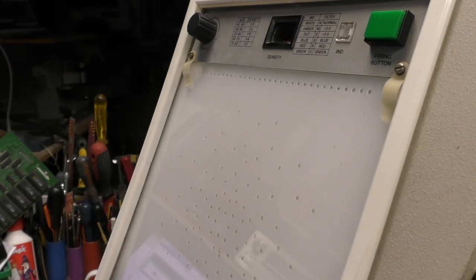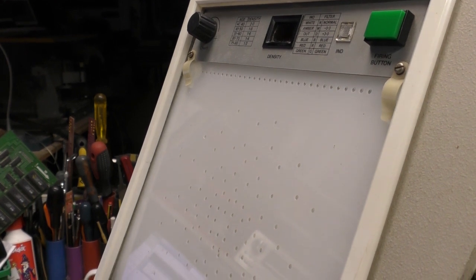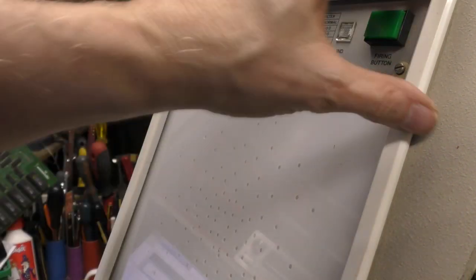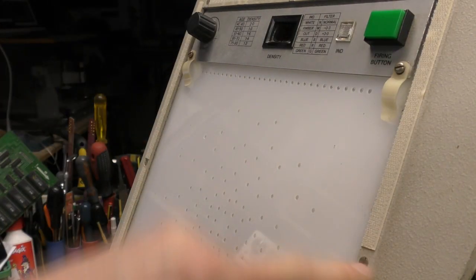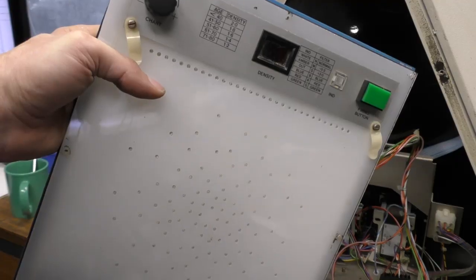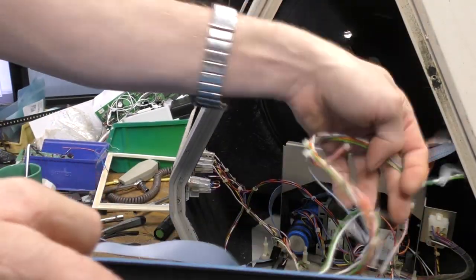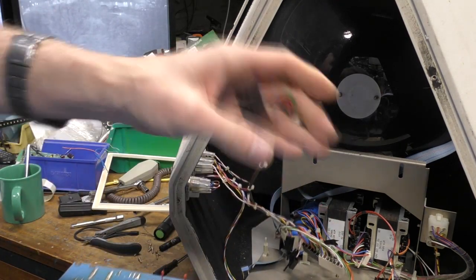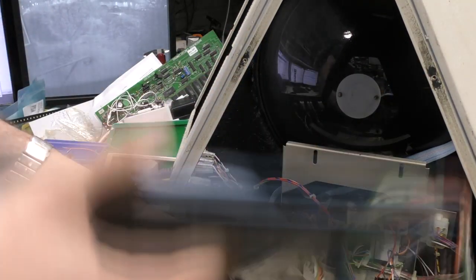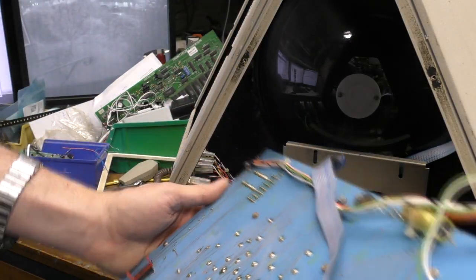Well, here's a novelty. I'm quite used to trying to find obscure hidden screws to get stuff apart, but I've never come across this one before. This frame around the front panel is held on with Velcro, and there's screws hidden behind that. This must be one of the most annoying things I've ever taken apart. I've got this front bit out, but then you have to undo a load of cable tied looms on the inside. There's some bits that unplug and then some bits that don't. It's just absolutely horrible. Must be made by people that really didn't give a toss.